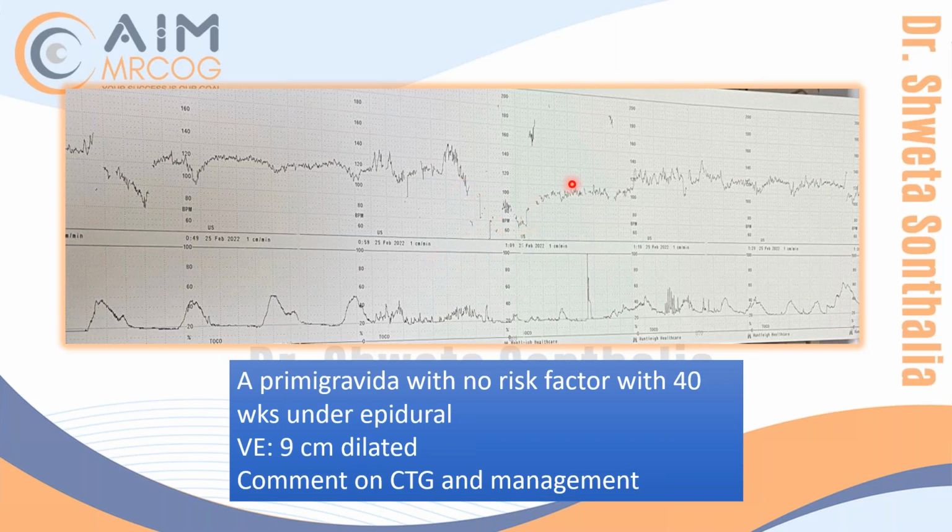Because this box is recovering from deceleration, from 100 definitely the baby will take a little time to recover. So maybe if you lost the baby here, loss of contact, gradually you are picking up the baby, so then the baby is fine here, right? Yeah. The good variability might be because of hypotension and then after some resuscitation.